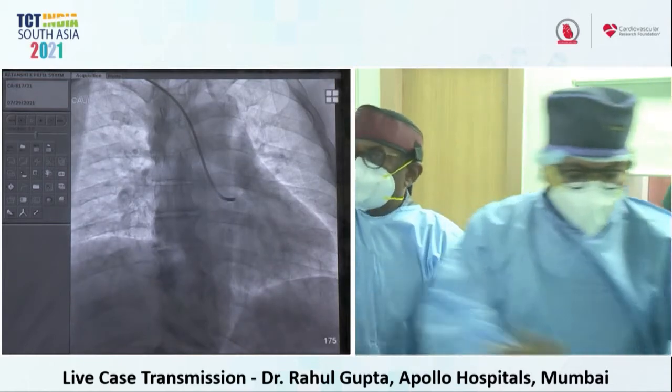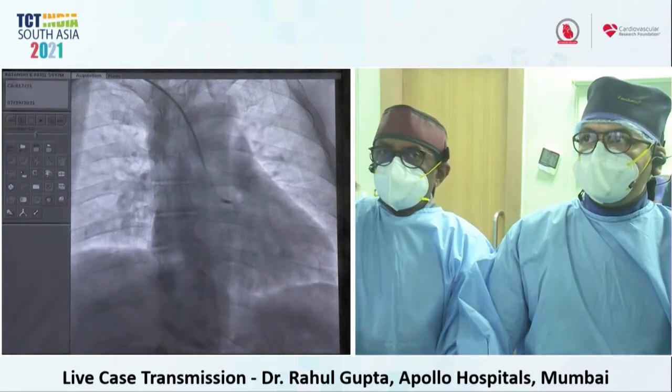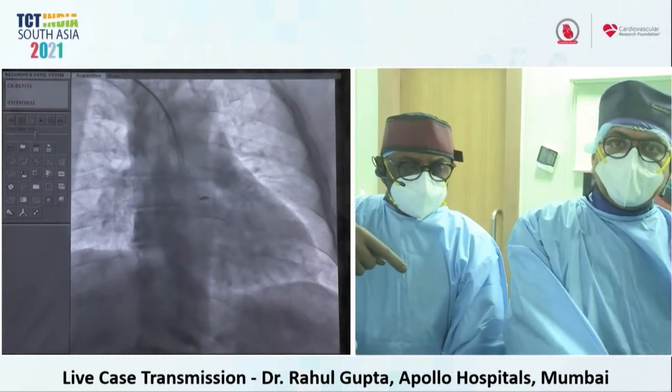If they show the radial site, you know, sir, there's no sheath there. It's directly only the guide now. No, it's a sheathless thing. Can you let them focus on the radial site once? If the camera can focus, then people will understand what is the difference.